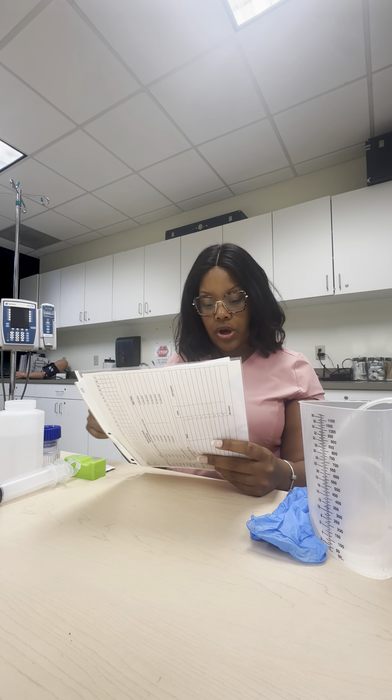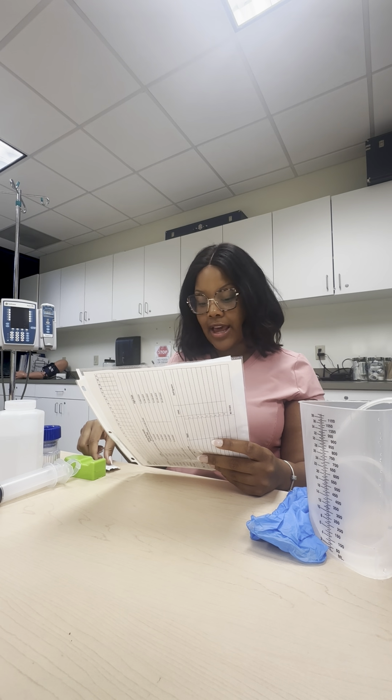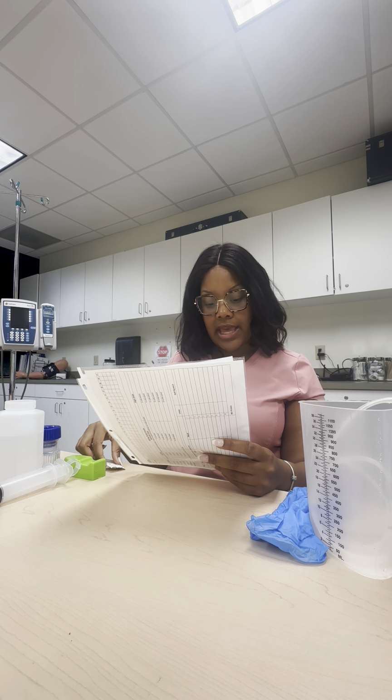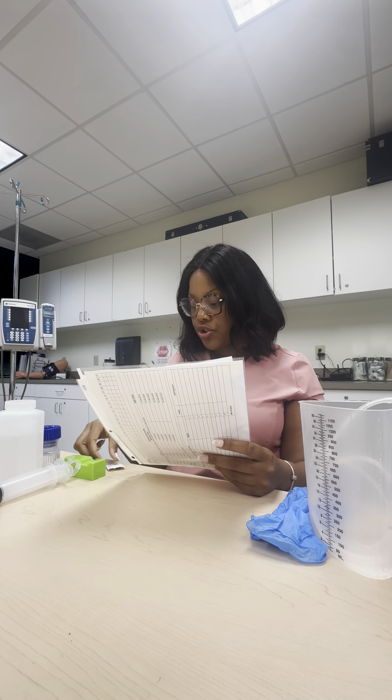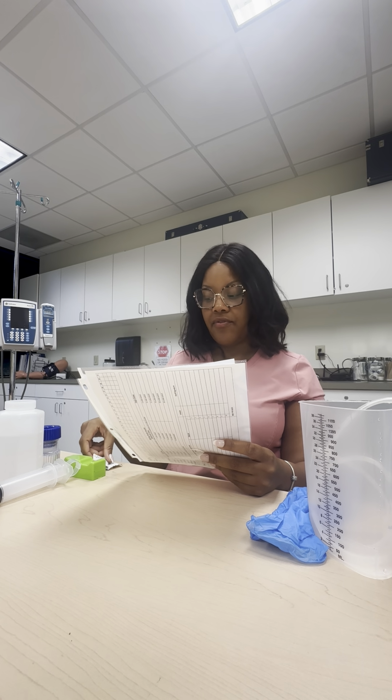Okay. So the other order it has is for your erythromycin. And that order is for 500 milligrams by the peg. And that's every 8 hours for an infection. So we want to make sure that we grab the correct dose. So in our Pyxis, we have 250 milligrams. So we know that we need 2 in order to give 500.